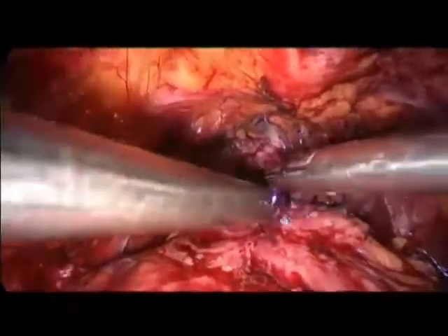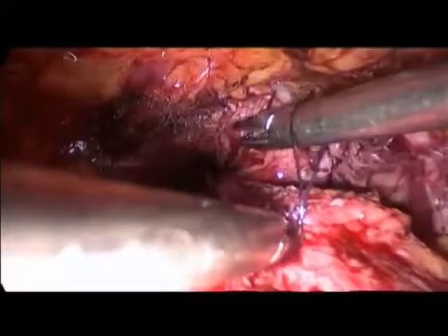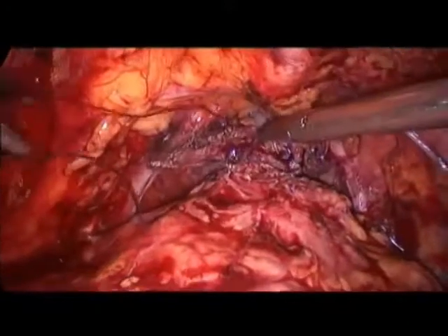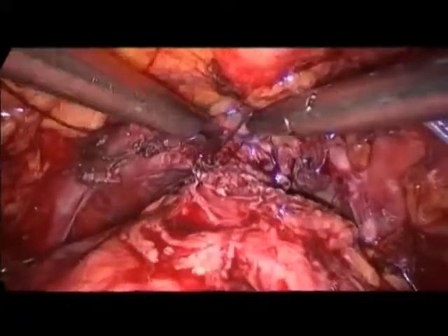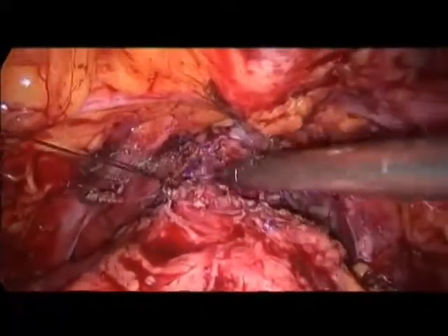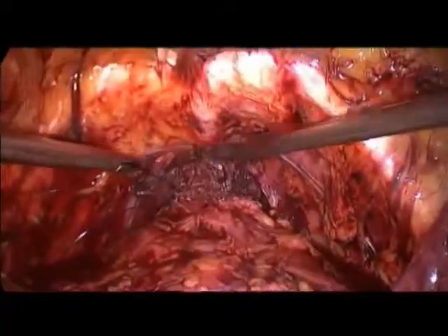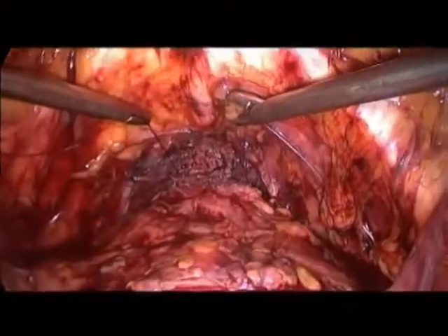So now we are just watching the way... So you are doing the whole circumferential part now with this continuous anterior suture. Yes, except, yeah, the anterior. Yeah, we are going to cut the small legs.